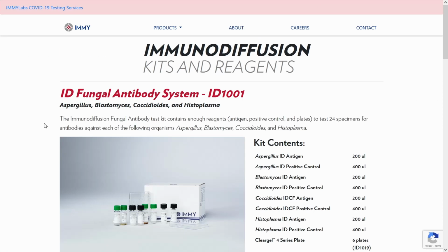This is the follow-up video to my first one about what I do at IMI. In this video, I'm going to be talking about immunodiffusion. So immunodiffusion: immuno, antibodies again, and then diffusion, things spreading out.